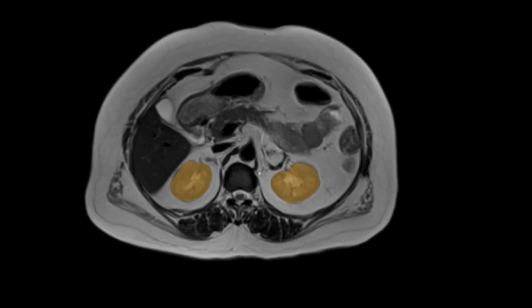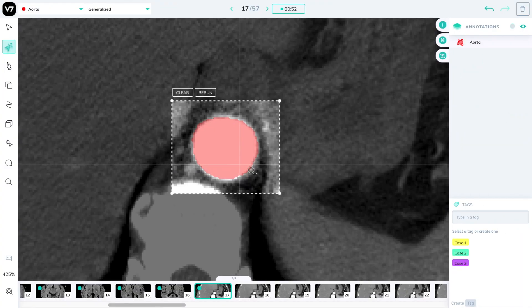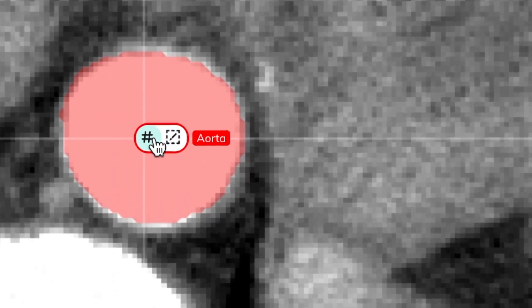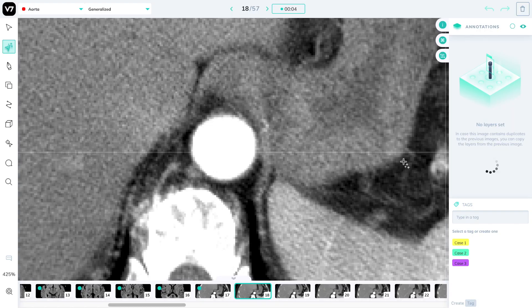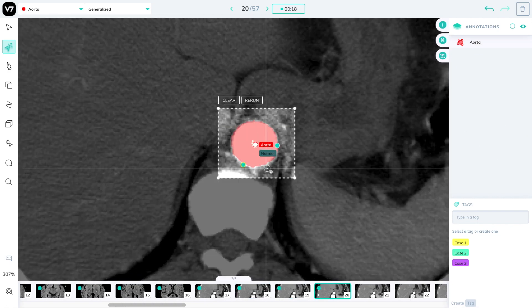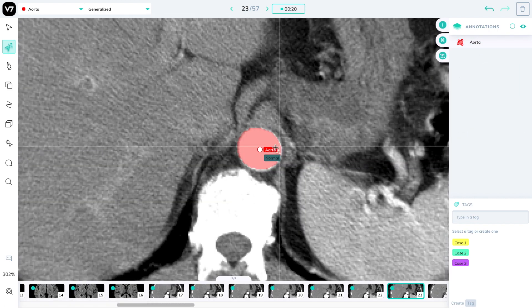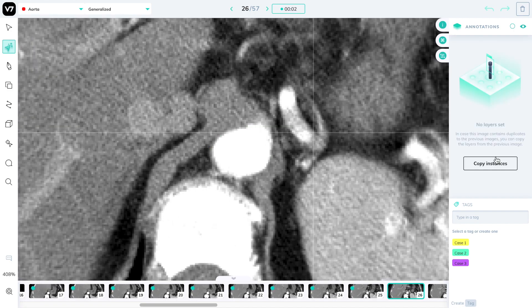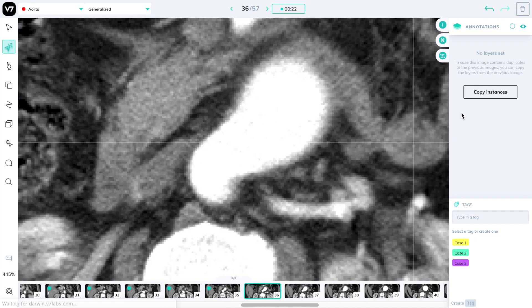Here's our final result for case two, which also only took us a few minutes. For our last case, we're going to segment this aorta and while doing so we'll add an attribute to it — the fact that it is normal. Attributes are like tags applied to annotations to give them more information. Each slice takes between 10 and 20 seconds to complete, and little by little we're creating a volumetric map of this aorta. As it starts to grow, auto-annotate adapts to it and reforms its shape.